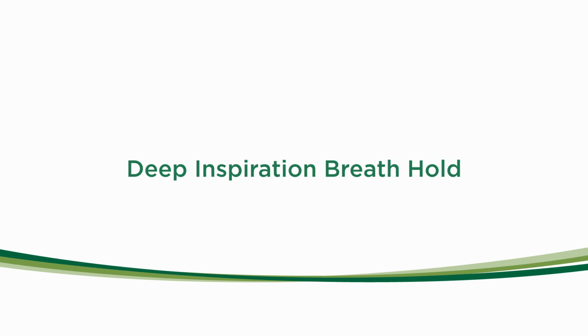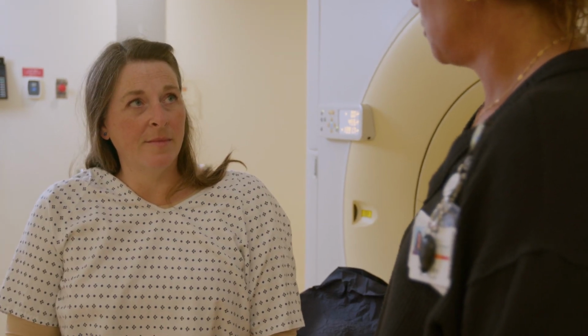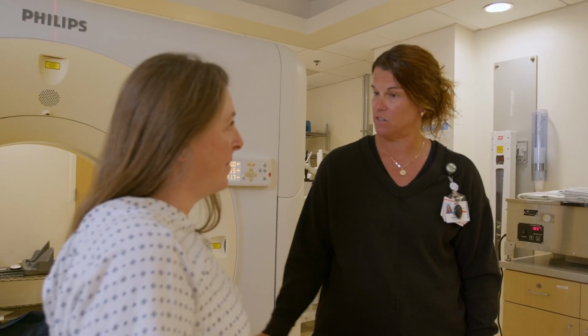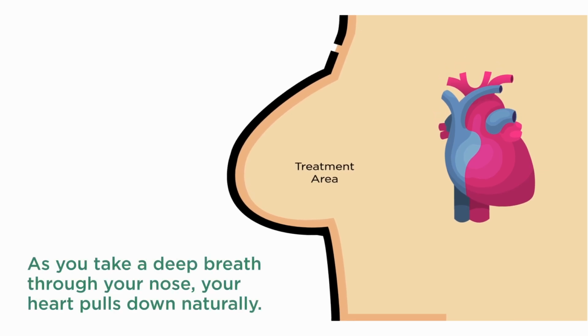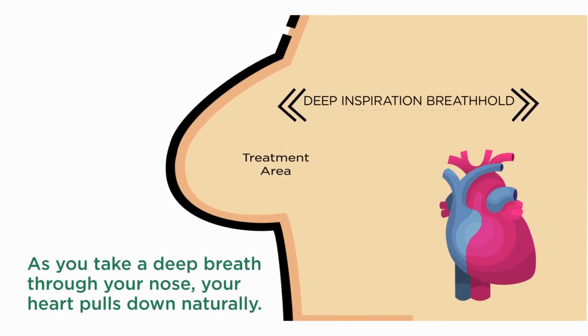So today we'll be explaining DIBH, which is a part of the treatment planning for patients who are getting radiation for breast cancer. It is one of the ways that we use to protect the heart during radiation planning for breast cancer. What it does is it moves the heart down as you take a breath, the diaphragm pulls it down, and the chest wall away. And that way it creates some space between the breast we're treating and the heart right behind it. It is one of the most effective ways that we have to reduce radiation exposure to the heart.